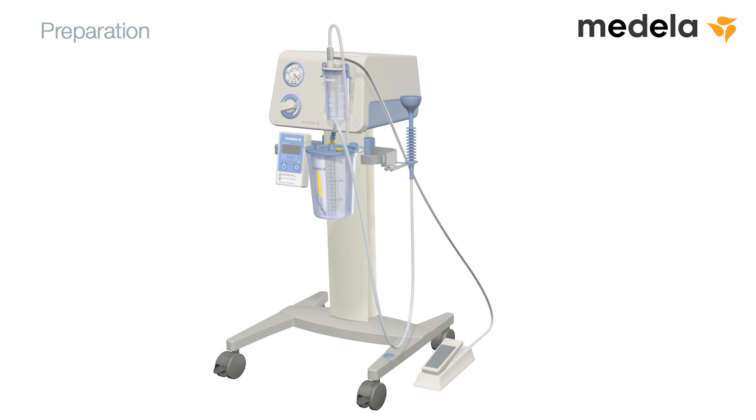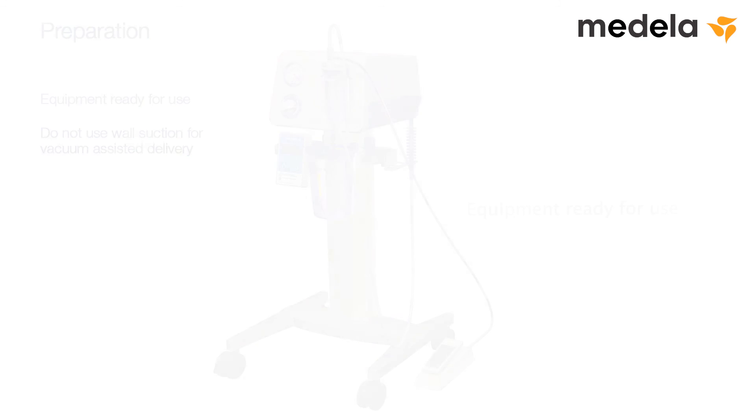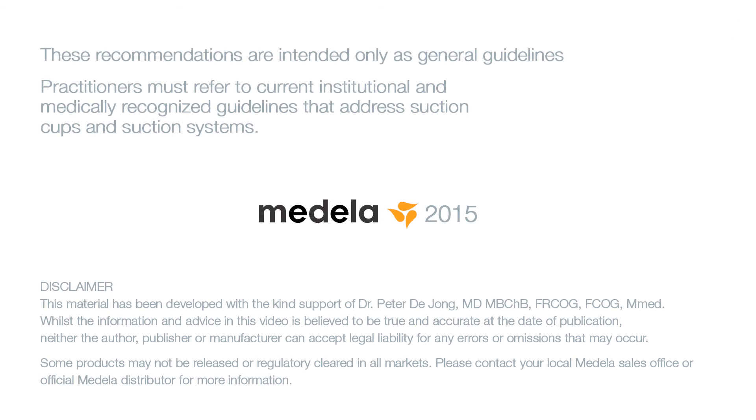The equipment is now ready for use in the vacuum-assisted delivery procedure. Please note that wall suction is not to be used for vacuum-assisted delivery. Practitioners must refer to current institutional and medically recognised guidelines that address suction cups and suction systems. These recommendations are intended only as general guidelines.